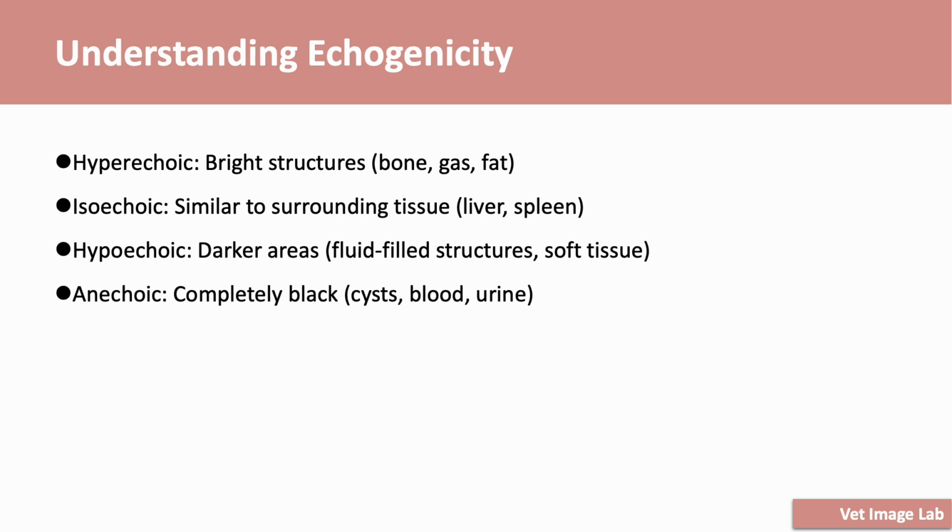As we have explored so far, in ultrasound imaging, brightness reflects tissue composition. So understanding echogenicity and recognizing changes in echogenicity are crucial for assessing disease conditions. Now, let's summarize echogenicity along with examples of typical tissues that correspond to each echo pattern on ultrasound.